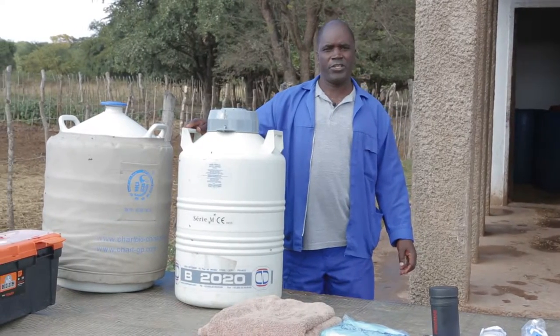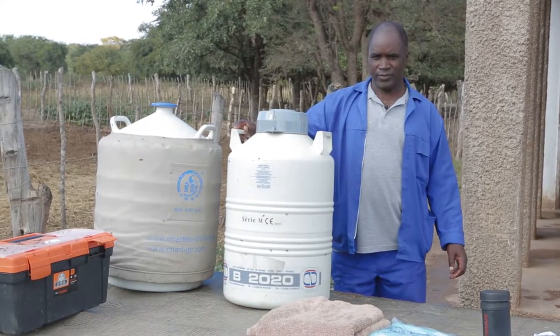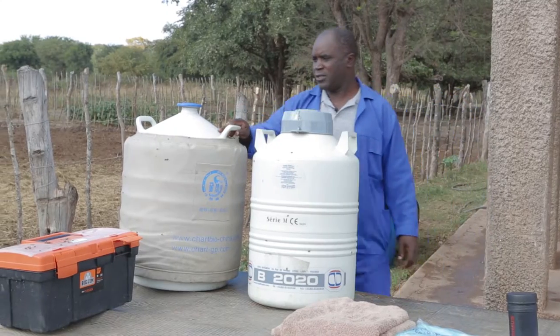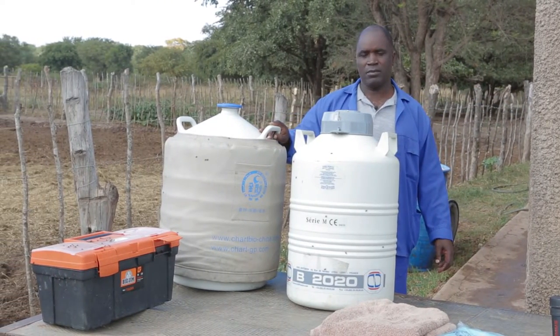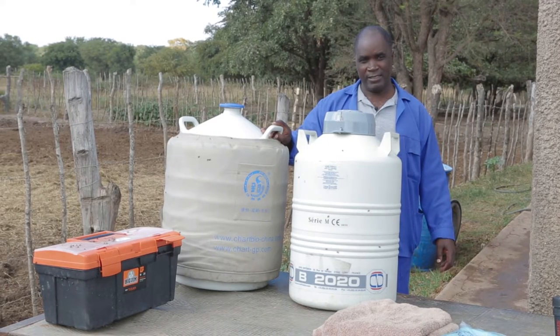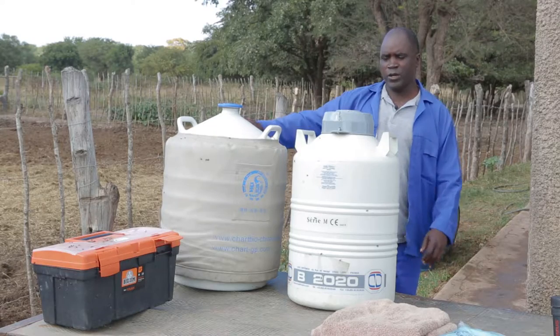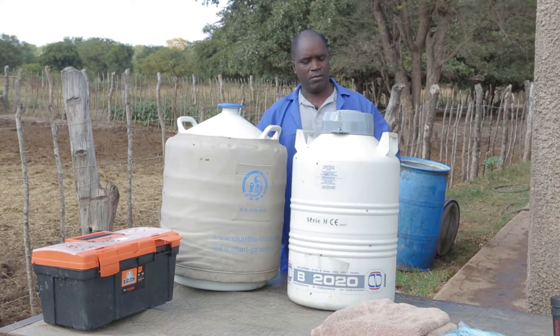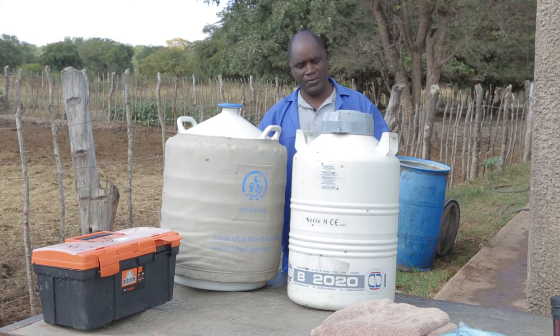This is the storage for our straws. This is a liquid nitrogen flask. It is a storage for the liquid nitrogen that we use in the storage of the semen.